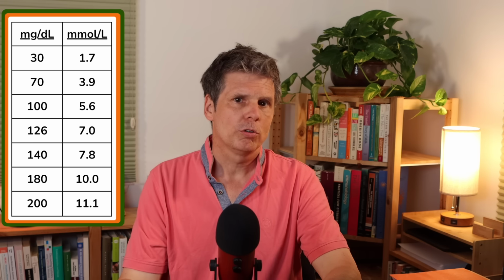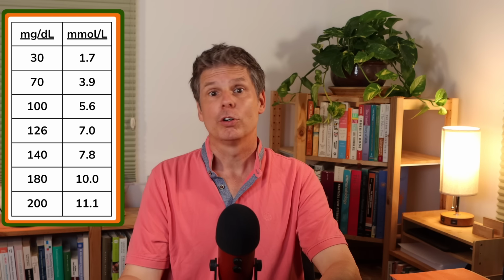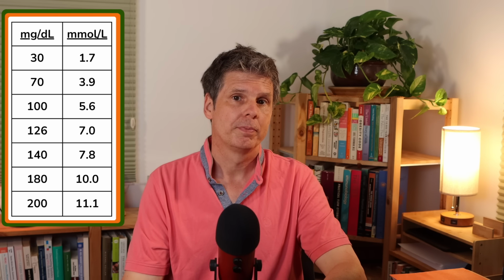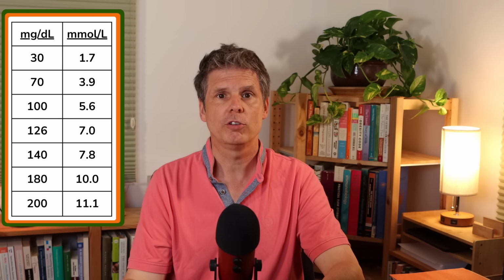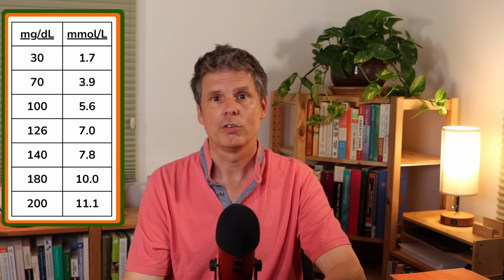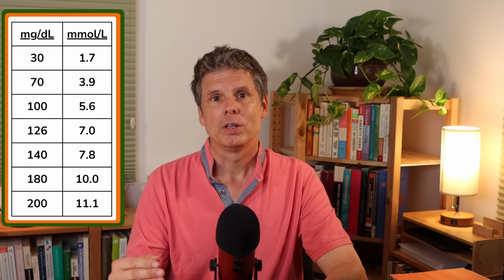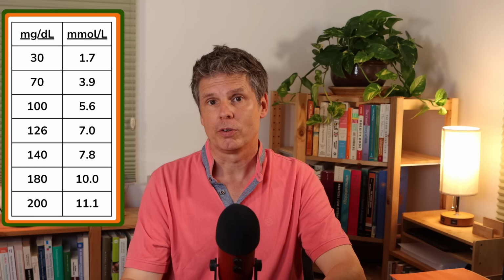Now, it's very important to be clear that our glucose responses to our meals can only shed light on whether or not we are glucose tolerant or intolerant if these meals do contain at least some carbohydrates. If you eat a low-carb meal of just meat and non-starchy vegetables, your blood glucose will not rise meaningfully, even if you are glucose intolerant. There's nothing wrong with eating low-carb or even very low-carb meals, but just be sure not to fool yourself into thinking that this means that your glucose tolerance is great.